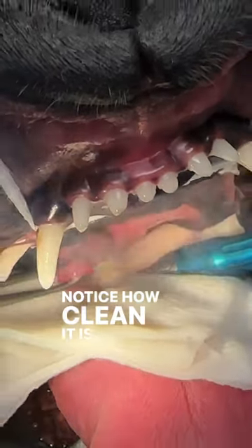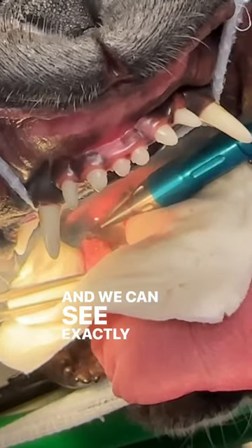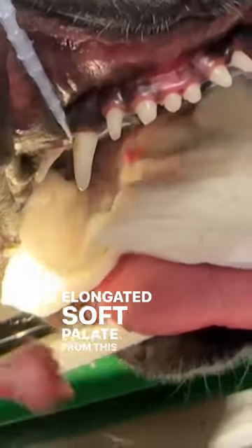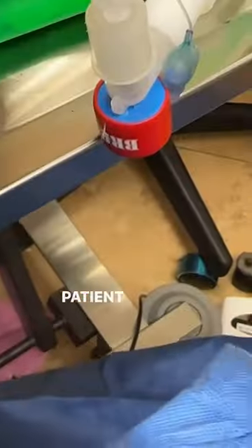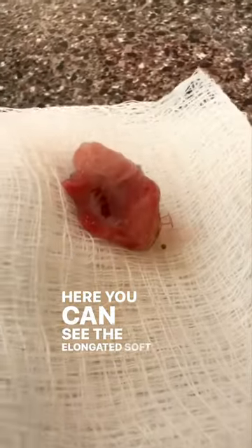Notice how clean it is, how there is minimal to no bleeding, and we can see exactly what we need to see. We remove the elongated soft palate from this patient's throat so this patient can breathe easier. Here you can see the elongated soft palate is being removed.